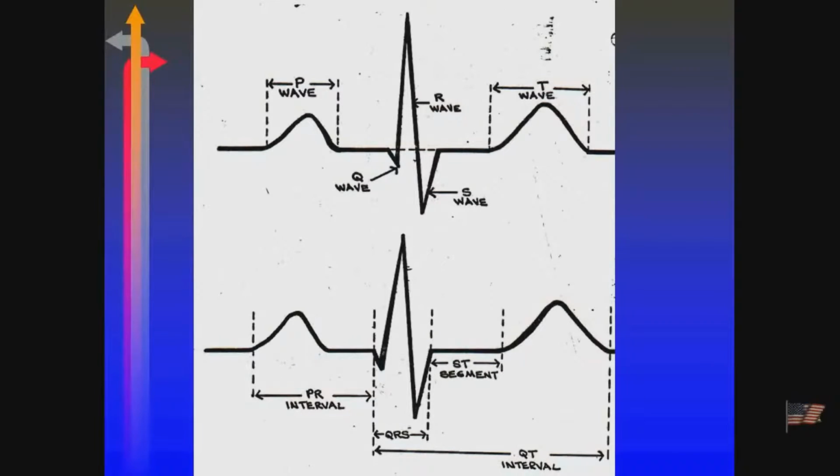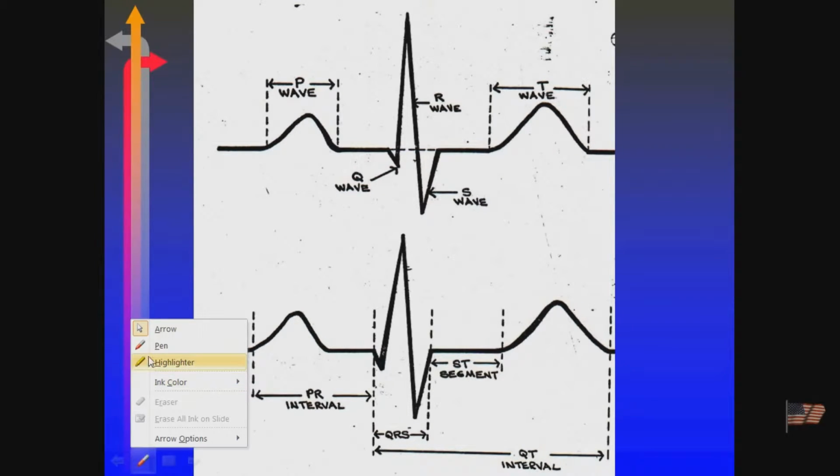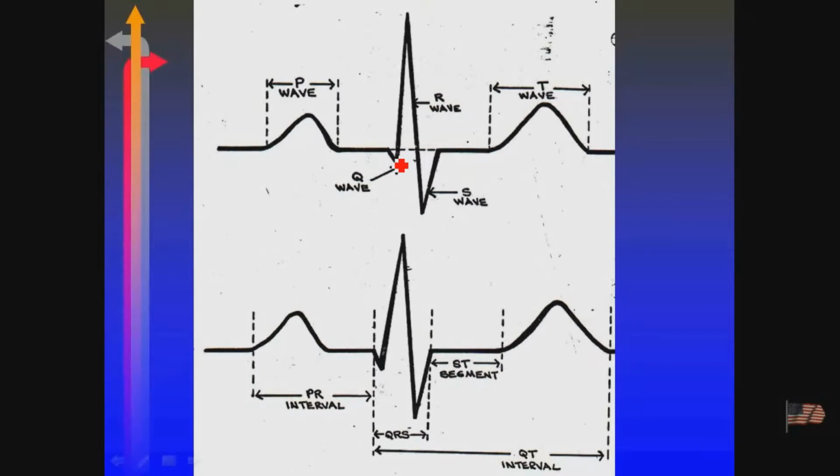So again, you should know the individual waves that are present. P wave is the first positive deflection that you end up seeing, especially in lead 2, where you would primarily be looking. By definition, the first downward deflection after the PR segment, and this is what is considered to be the PR segment here, is the Q wave. So this portion right here is the Q wave.